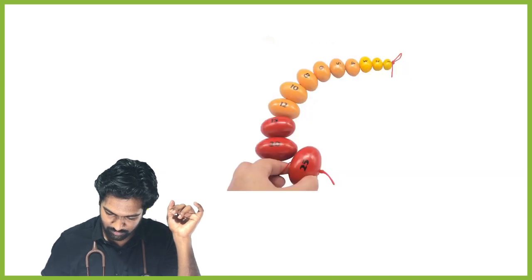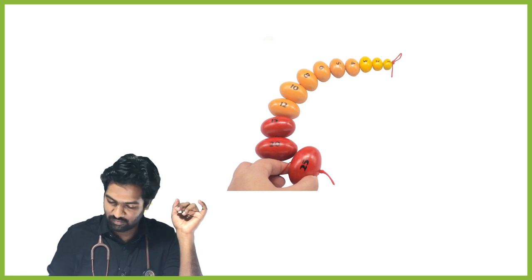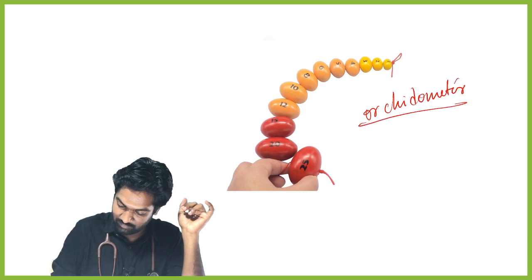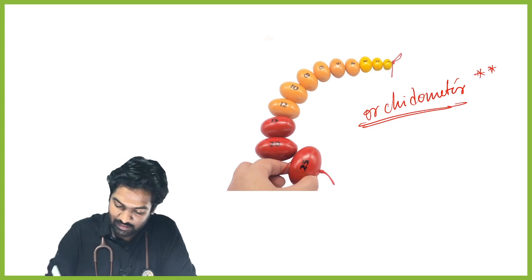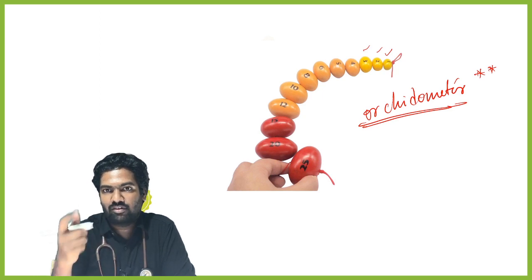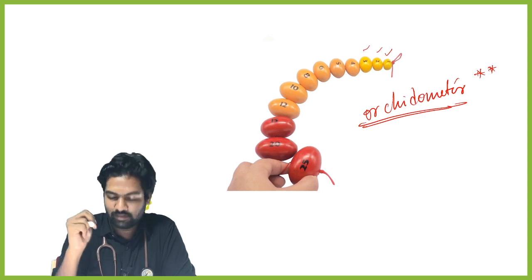Need based image questions. We'll see what is first. Anybody who can tell this? This is called an orchidometer. The moment they show this, it is asked; you can see it in your NEET question banks. The different sizes of this can be likened to the testes of a male child, and you can get to know how he has matured.